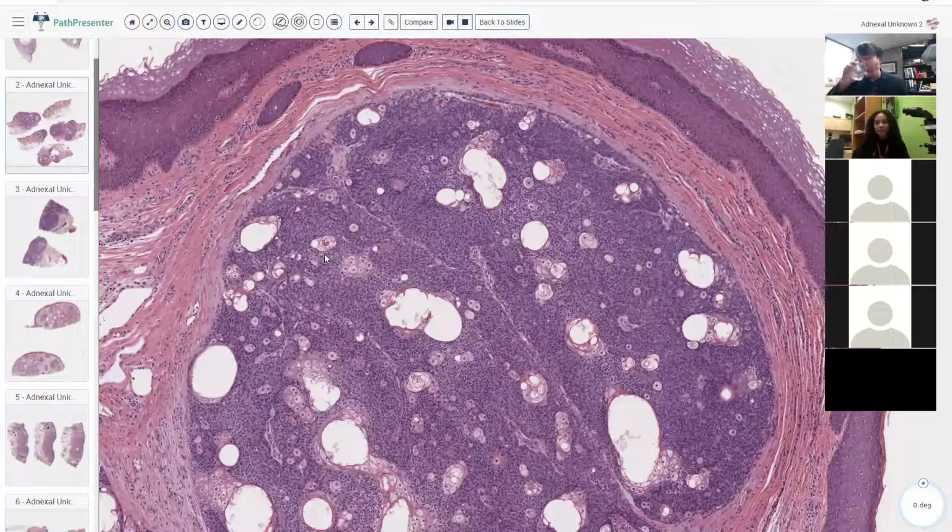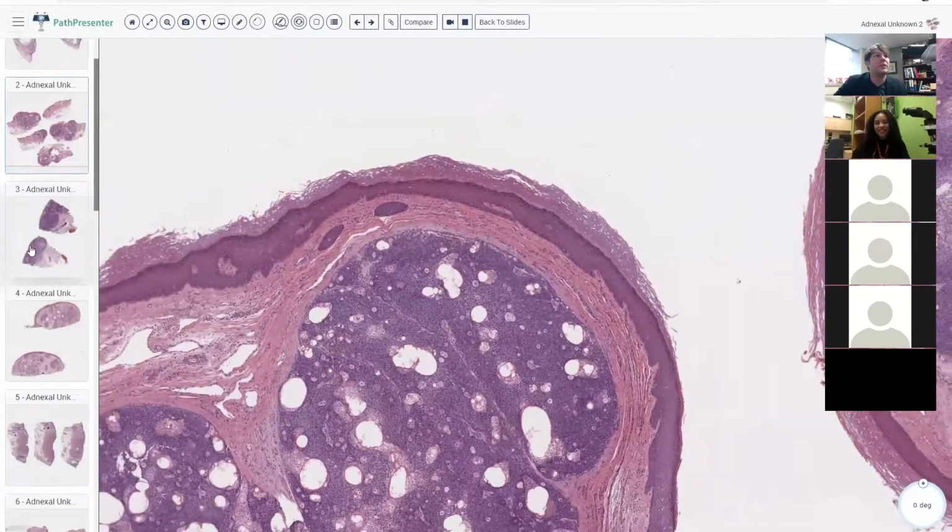I appreciate it. Now, this is a sebaceoma. All right, so let's move forward.